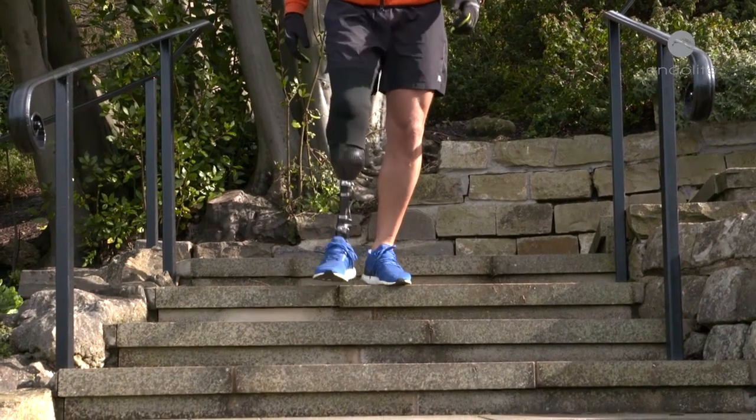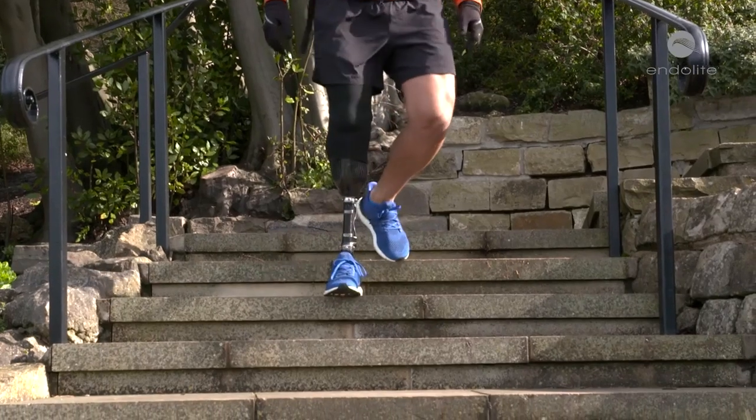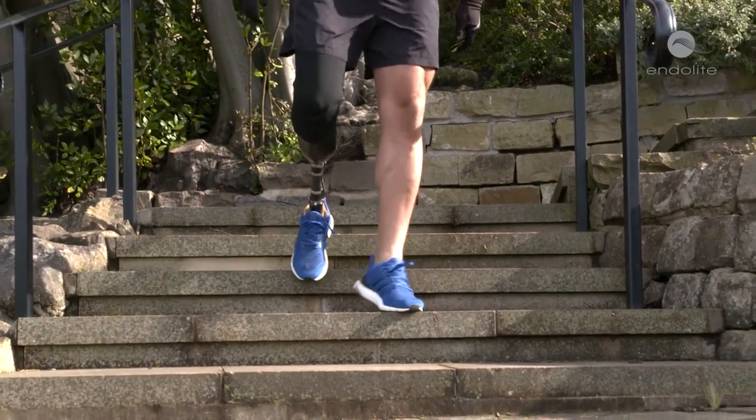The Echelon VAC combines the benefits of an elevated vacuum system with a hydraulic ankle. It's lightweight, has low build height, doesn't require batteries, and is quick and easy to fit.